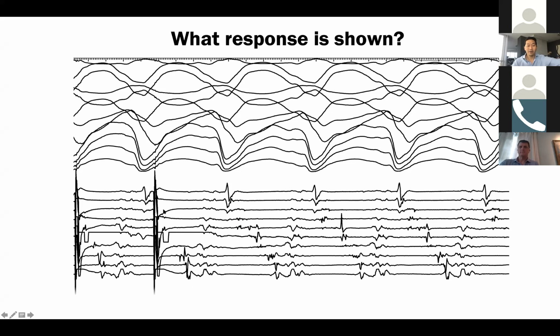Here is the entire circuit, all of diastole. And I was only interested in this middle electrogram, but look at what happens to the electrogram above it. Here, all of this is captured as well, because the only thing you see is this last component, which is this third component. Component 3, 2, 1. You're capturing 2 and 3 because it's gone, and you're likely capturing 1 because it's also gone. And if you go one more up above it, you can see these electrograms are hanging out right there. So the point is, this is multi-electrode evidence that we're capturing way more than we want to.